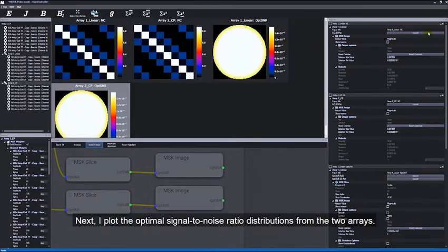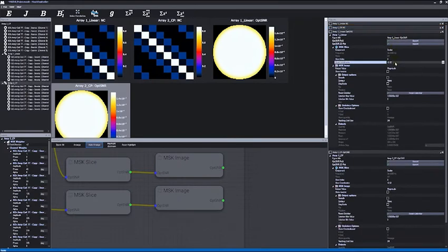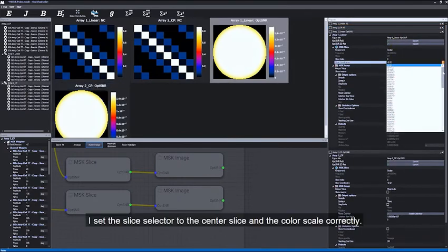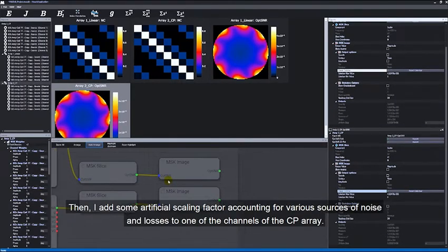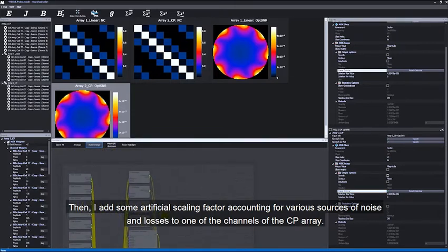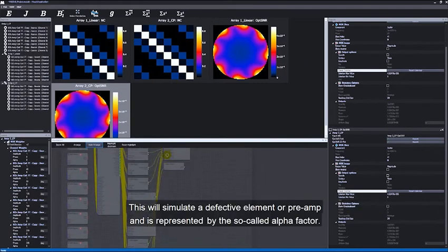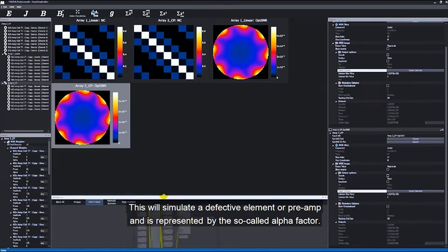Next, I plot the optimal signal-to-noise ratio distributions for the two arrays. I set the slice selector to the center slice and the color scale correctly. Then I add some artificial scaling factor, accounting for various sources of noise and losses, to one of the channels of the CP array. This will simulate a defective element or preamp and is represented by the so-called alpha factor.